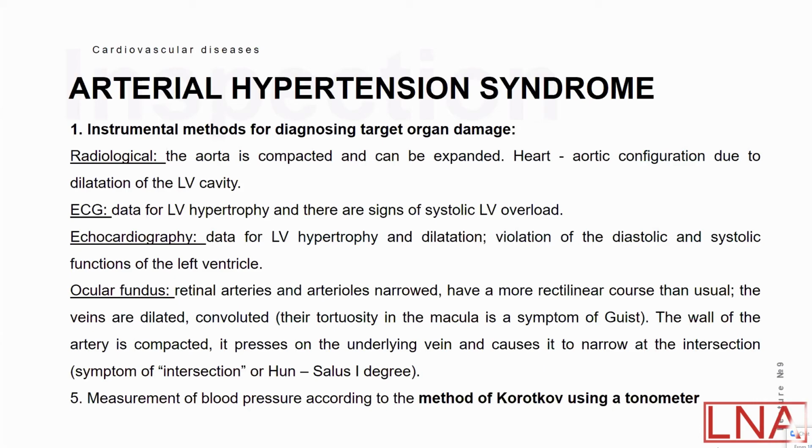Now the instrumental methods for diagnostics and target organ damage in patients with arterial hypertension syndrome.